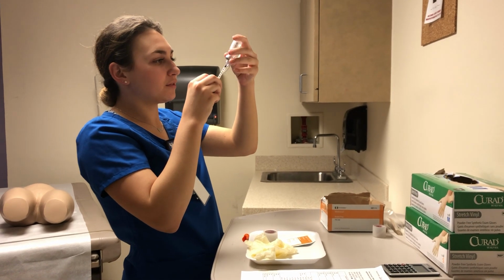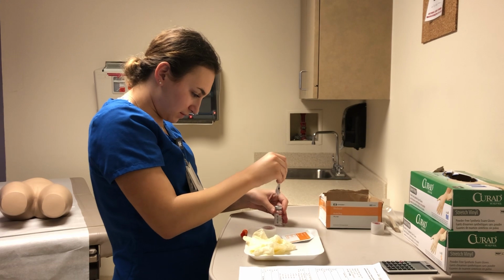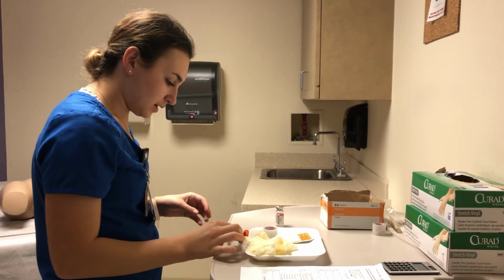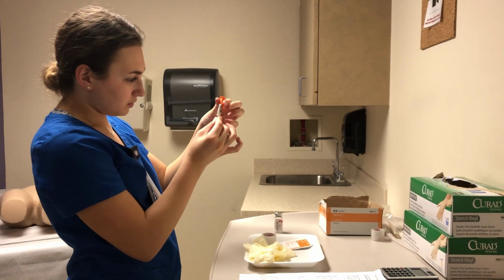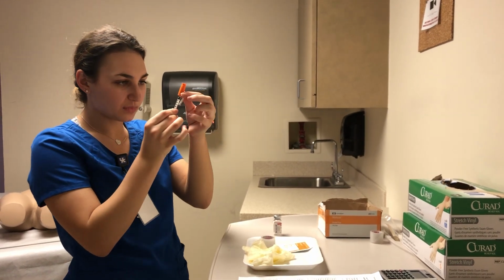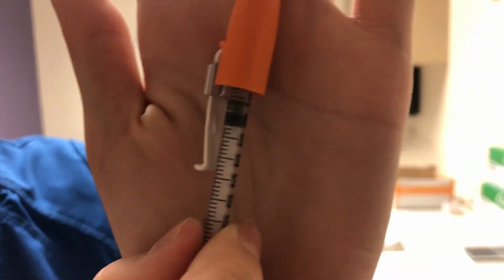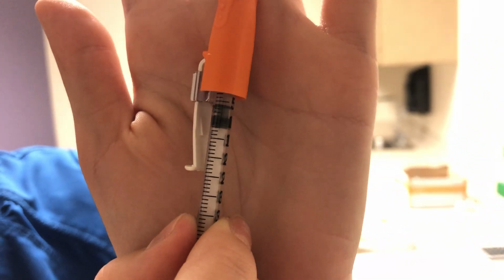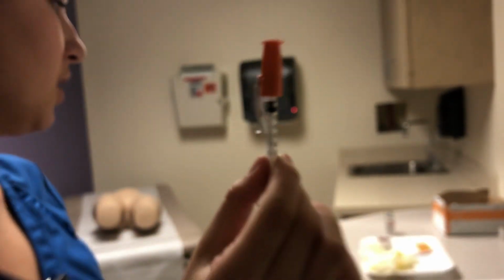Okay, so I have 6 units of insulin prepared. I'm going to take my needle out, and then I'm going to do a one-handed recap. And then I am going to ask you to verify how much is in the needle, or in the syringe. 6. Perfect. So my syringe is prepared.